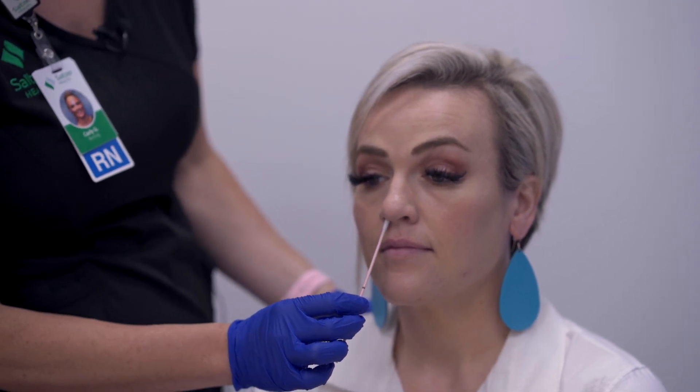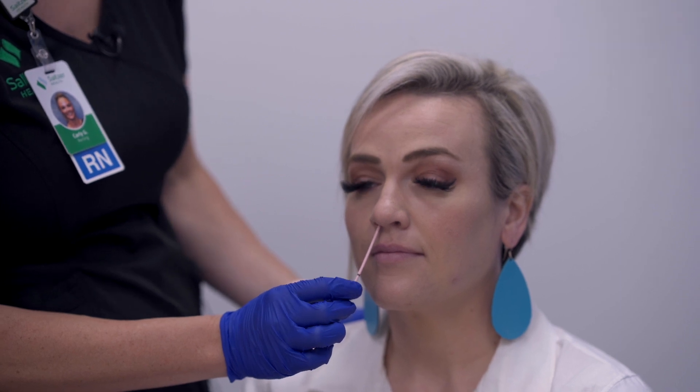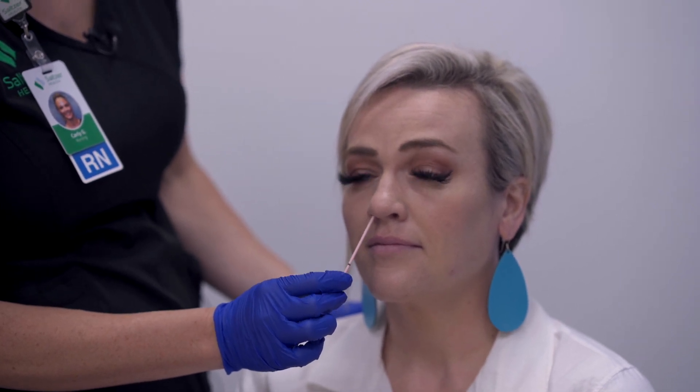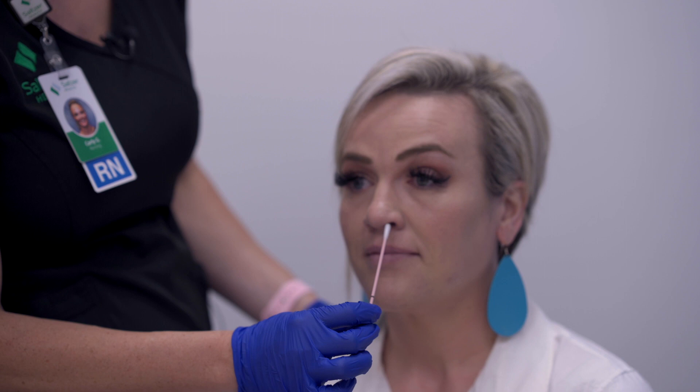Go right in until you feel a little resistance, then circle the side of the nose for about five seconds, making sure you're getting the side of the nostril. Go ahead and pull out and repeat on the second side.